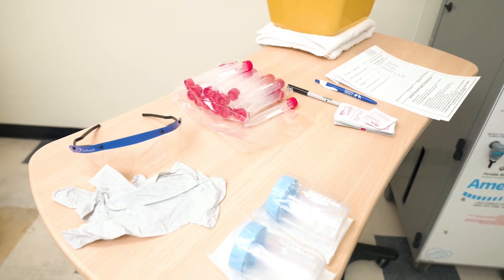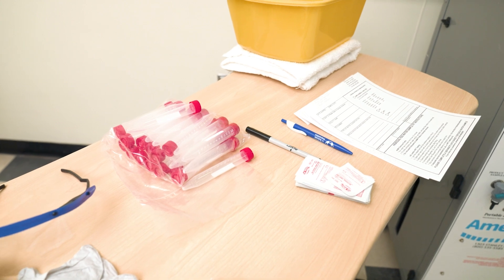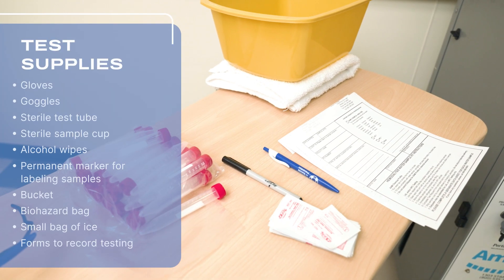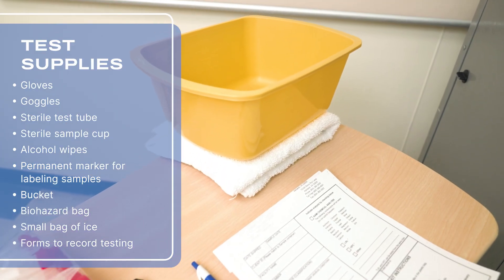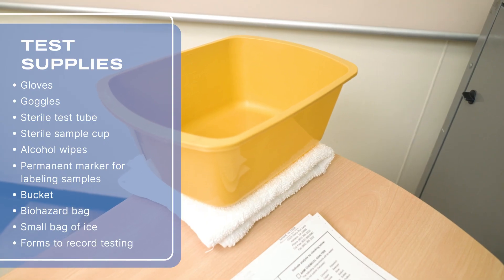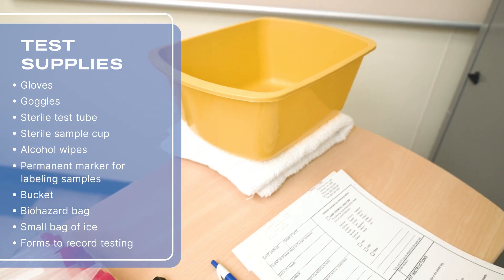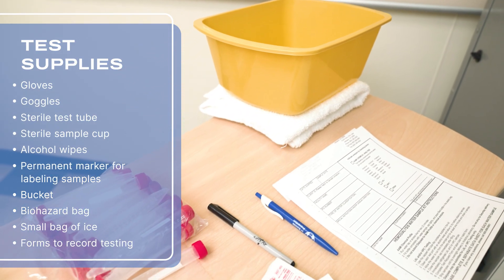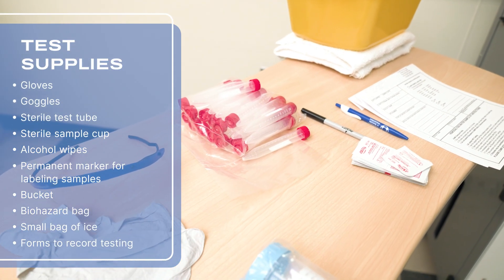Take a moment to gather all the supplies you'll need, as the requirements may vary for each test. For these tests, you'll need gloves, goggles, a sterile test tube, a sterile sample cup, alcohol wipes, a permanent marker for labeling samples, a bucket, a biohazard bag, a small bag of ice, and forms to record testing.